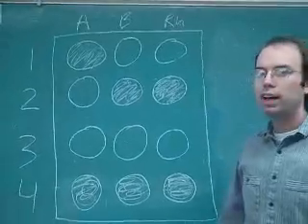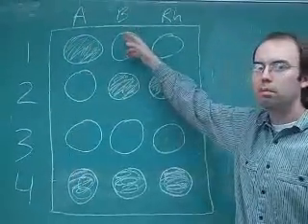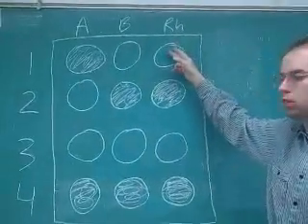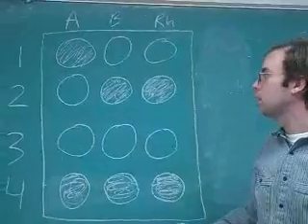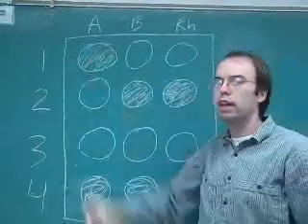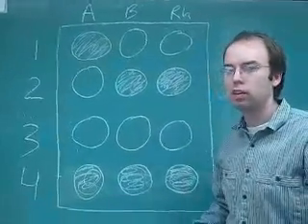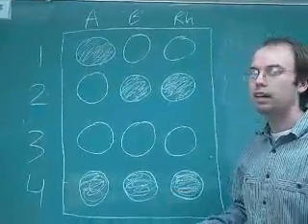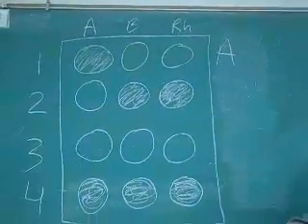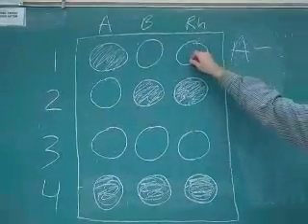And so we added antibodies to type A antigens here, antibodies to type B antigens here, and antibodies to Rh factor here. Okay? This particular person had only clotting with the A antibodies. That means only A antigens were present. There's no B, there's no Rh. If only A antigens are present, you have type A blood. Also, you have a negative blood because Rh negative.